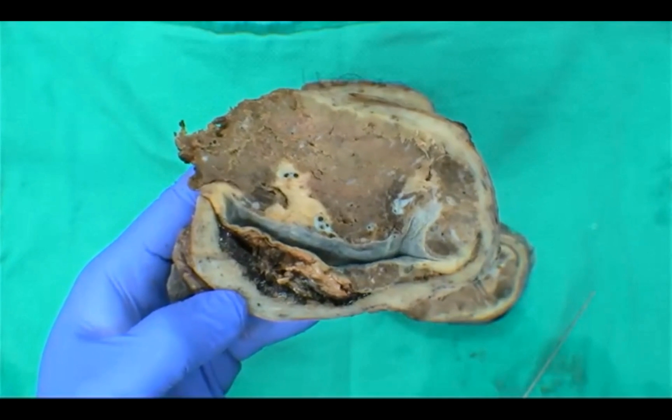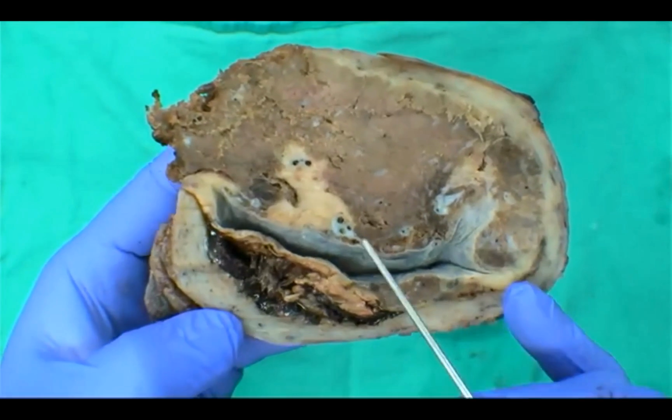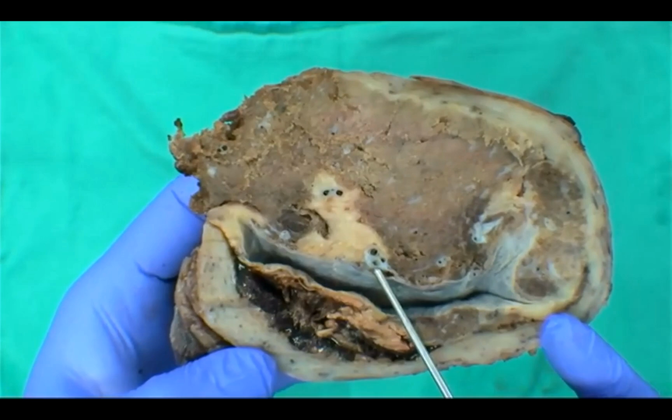That's a very nice shot of a clot in organization. Actually, that's a good question. So I think these are just little vessels there. They kind of look like little umbilical cords.